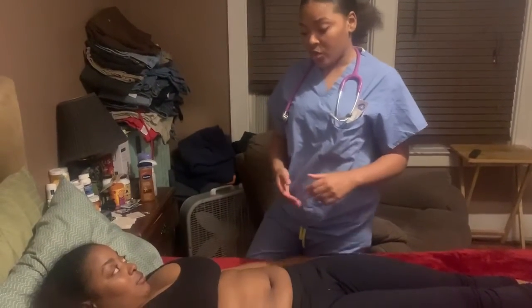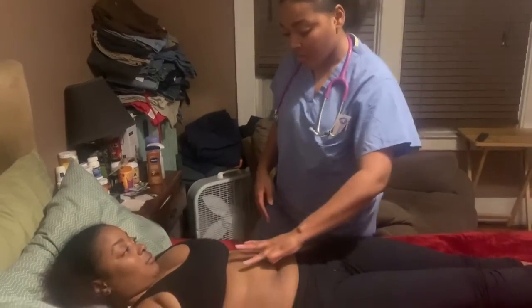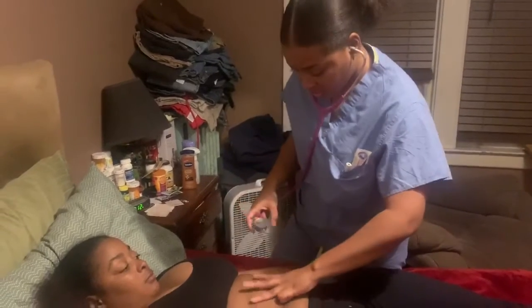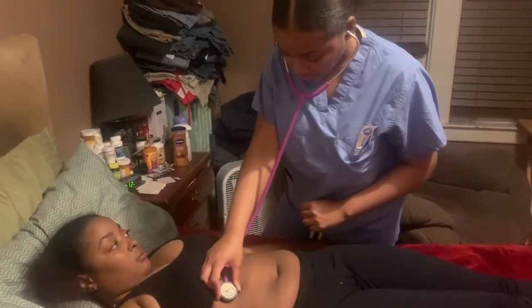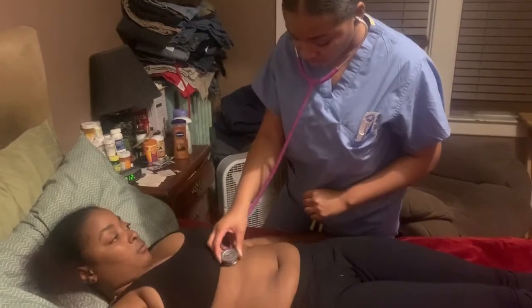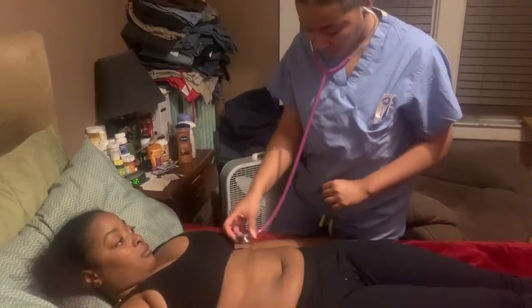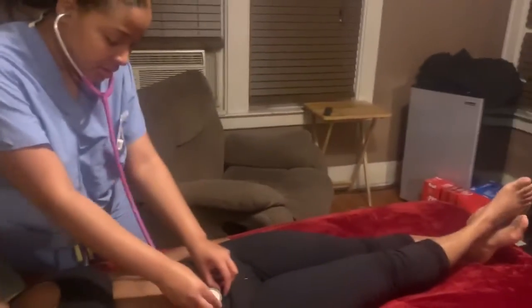The next thing we're going to do is listen for bruits or anything in your aortic, iliac, and renal areas. How we find those: you put a W on the stomach. This is the renal area, and this is the aortic area. We're going to listen to those with the stethoscope, and we'll listen with the bell of it. So we'll listen to the renal. Aortic. And the renal. Then we'll listen to the iliac. We'll make a V shape and we'll listen here.